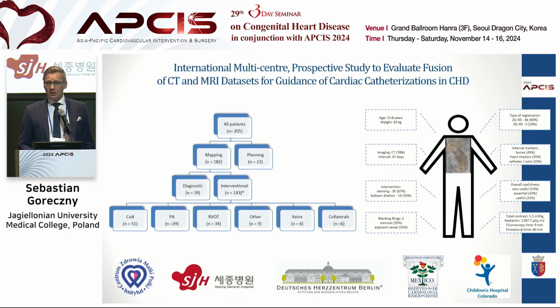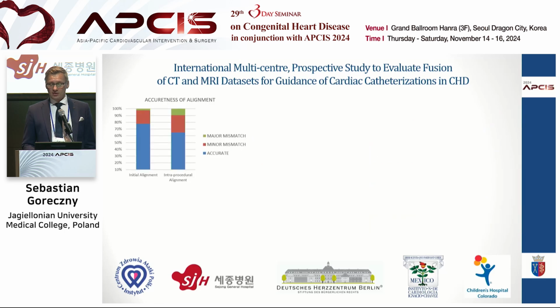And then to combine our single center experience, I invited several centers to share their experience, including Sengho's hospital and his center, and centers in Berlin, Mexico, and US. So we got together over 200 patients, and in 182 patients we used it for actually guiding cardiac catheterization. And just a few thoughts from that research.